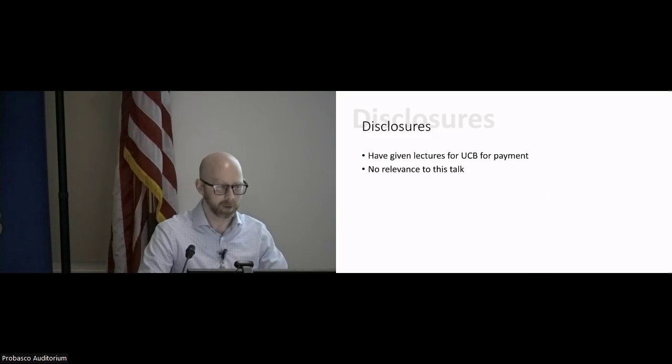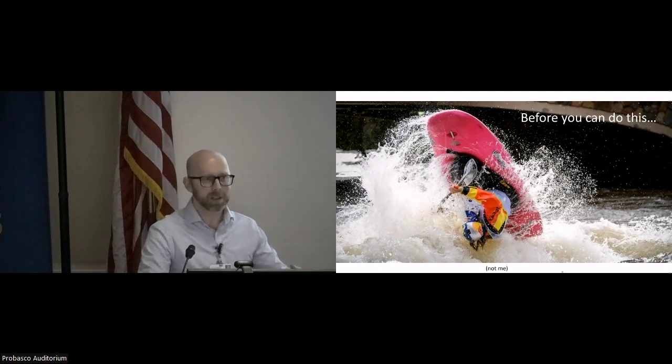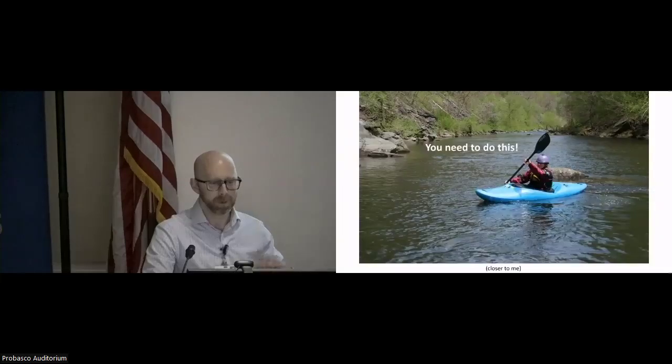This EEG talk though. And so, we always start with these. Normally, these lectures are really advanced ICU EEG patterns, and that's what we always go straight to. But the theory I have is that before you can do these crazy tricks and learn the advanced stuff, you need to learn the basics. You need to learn to walk before you run.